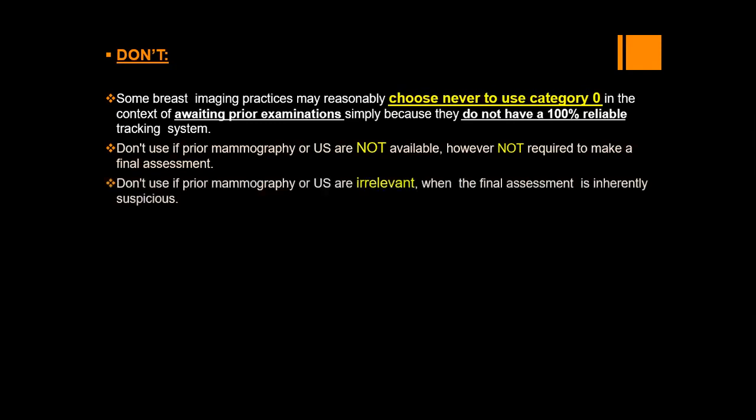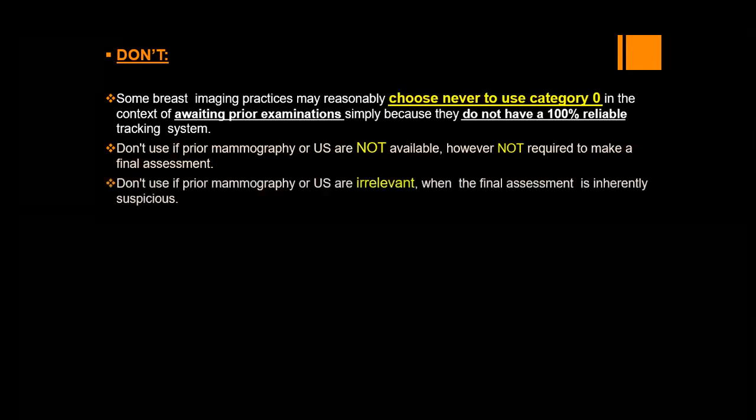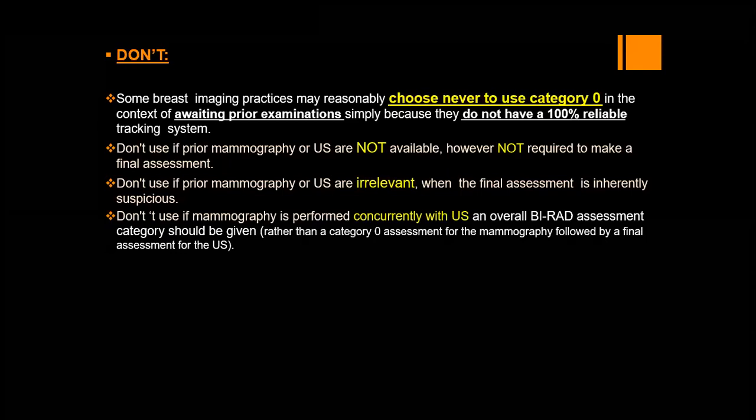And also don't use BIRADS 0 if the findings are inherently suspicious, so the assessment is not going to be affected by the previous images. No need to wait and to put BIRADS 0.